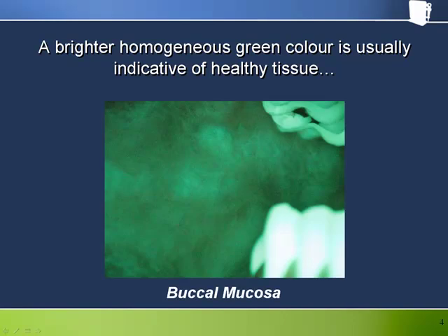Here we see the buccal mucosa with the highly fluorescing teeth on the right of the picture. The buccal mucosa is also typically green but is a high risk site for trauma and consequent inflammation. It is quite typical to see at least some little patches of darkness, as we see in this picture at the back, which shows some mild trauma and inflammation with a resultant dark patch through the Velscope.